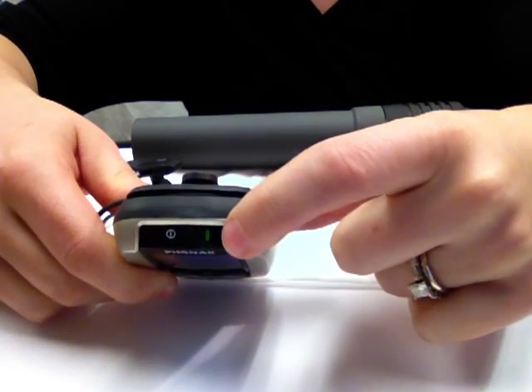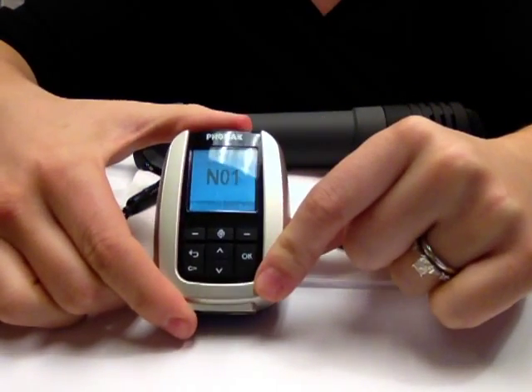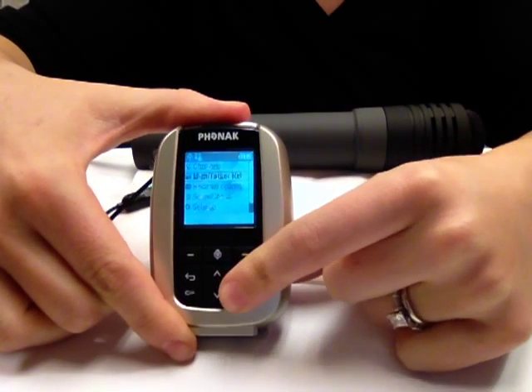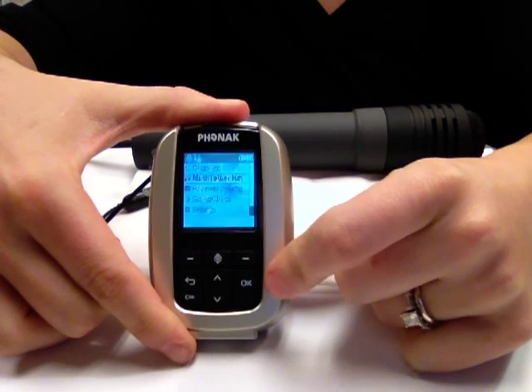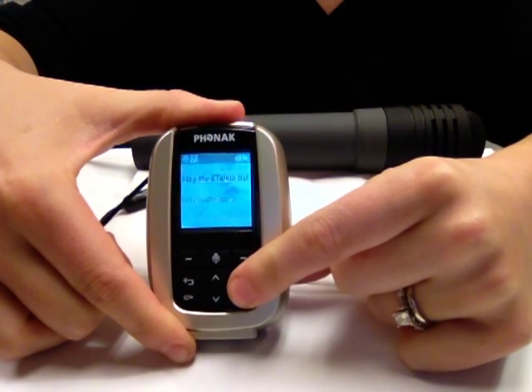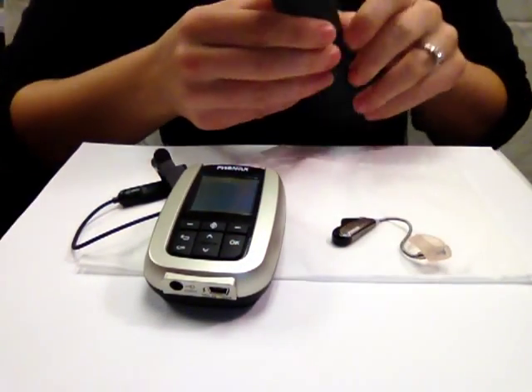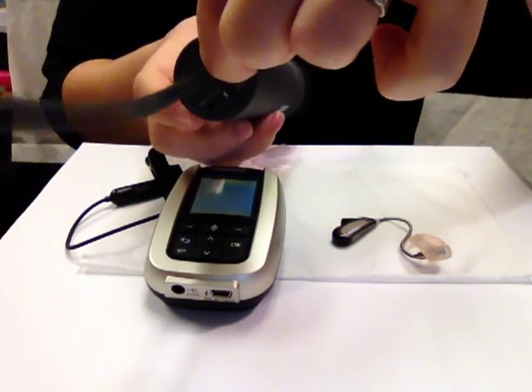You should see green under the slider. Initiate the multi-talker network by pushing the OK button. Then, push the down arrow once to highlight multi-talker network. Push the OK button. Push the OK button again to activate the multi-talker network setup. You can turn the DynaMic on now by turning it over and moving the switch that is on the bottom by the antenna. You will see a red light.